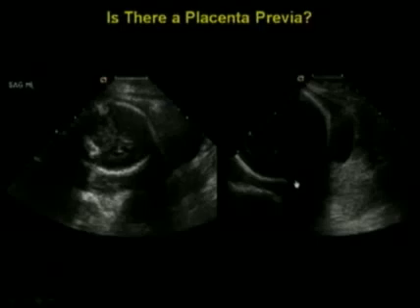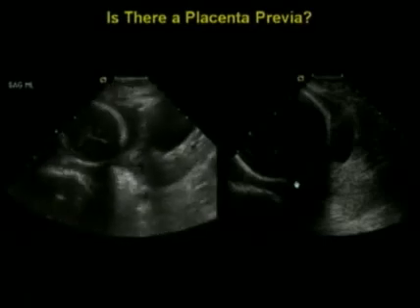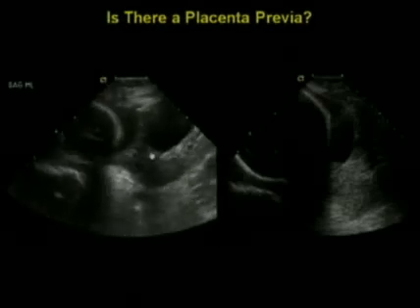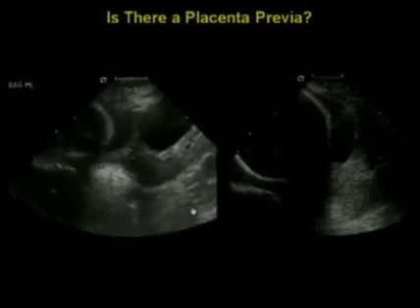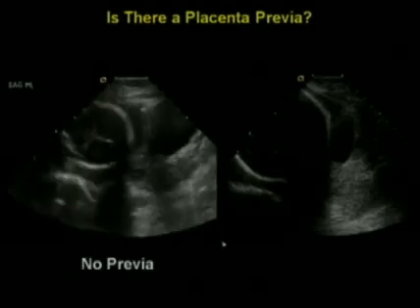So what we would do in these cases is try and push the baby's head up. And as you'll see in a minute, in both of these cases, I was scanning with my right hand. I used my left hand to try and lift the baby's head. And once the head was lifted out of the lower uterus, I could tell. So watch what happens on the image on the left when I push. Push, and the head goes up. And when the head is up and away, like right now, there's no placenta. So by pushing up, we get an answer to, is there a placenta previa? The answer is no, no previa.